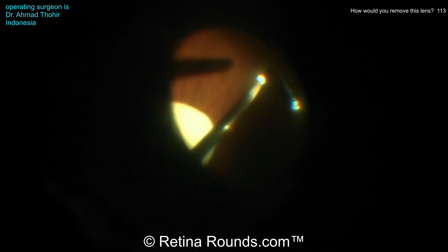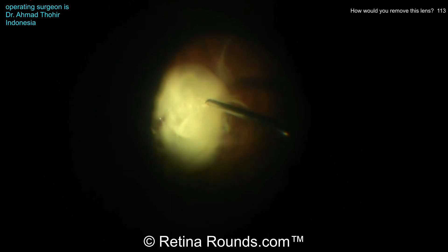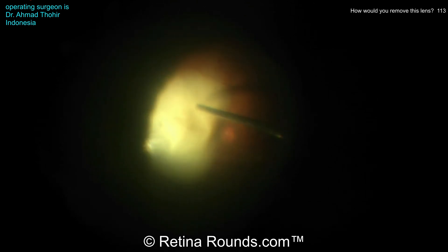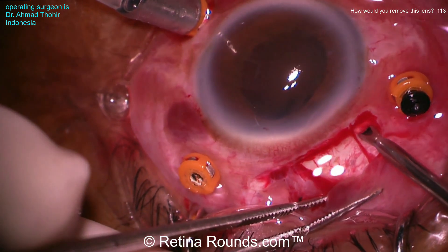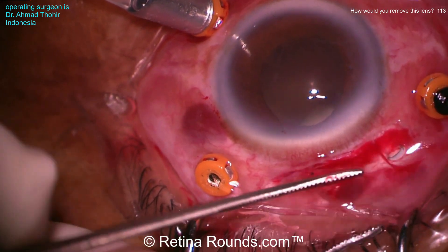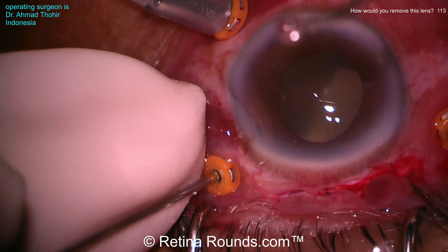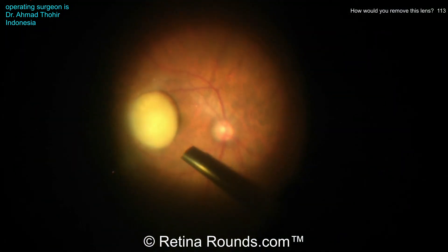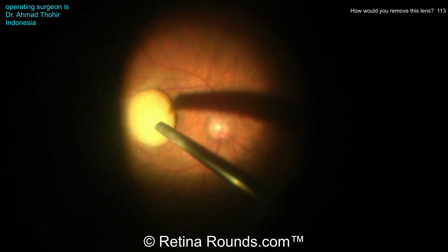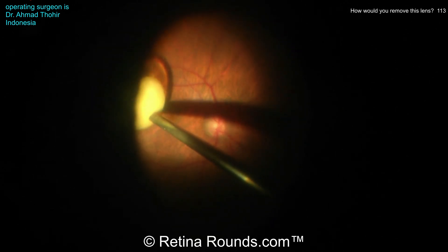This is 23 gauge vitrectomy, so larger gauge instrumentation is being used here, and Dr. Tohir is going to try to engage the lens with the vitreous cutter. The capsule has been incised with the vitreous cutter and some of that milky cortical material has been removed, but there's a denser nuclear fragment that's still there. So Dr. Tohir is going to convert to a phacofragmentation probe, using a 20 gauge MVR blade to make a separate sclerotomy and introduce the phaco fragmentation probe through it. When using the phaco frag, it's a good idea to make that wound just a little bit bigger because heat generated from the probe could potentially burn the sclera, making closure more difficult.